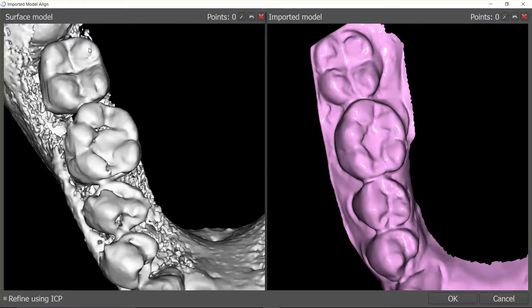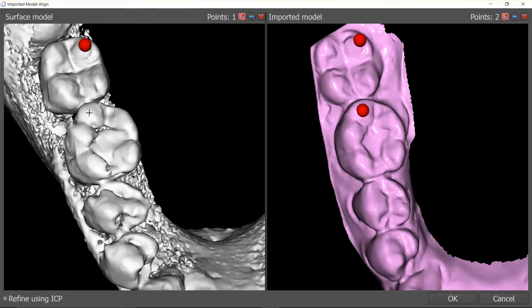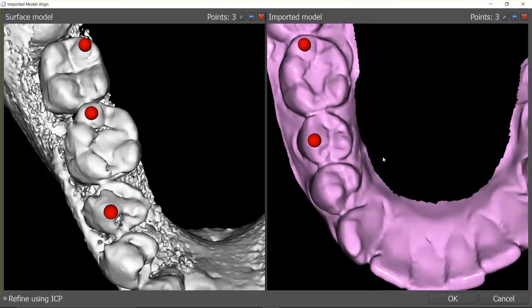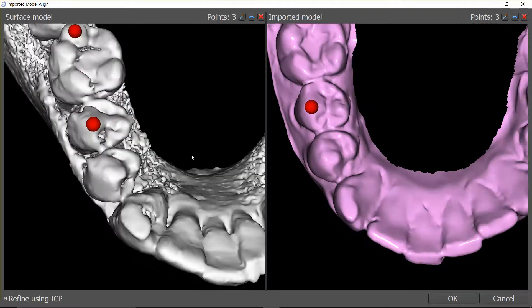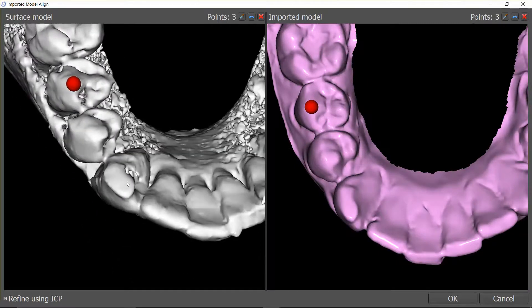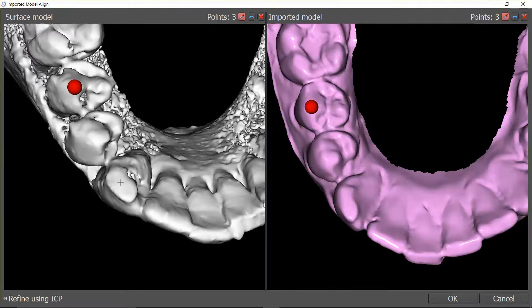I'm looking for distinct things: cusp tips, occlusal grooves, wear facets, and incisal edges — those are all really nice stitching points. This looks like a very distinct cusp tip; I'm going to put one right on the tip. Then I need to do the exact same thing on the other model, and we do that by pushing shift, which turns the cursor into a crosshair that you can drop a point with. I'll proceed around the arch. You want to get some buccal, some lingual, and definitely spread them out anteriorly and posteriorly, because otherwise you can end up with a great stitch posteriorly but lose it as you move farther away. Coming toward the anterior, I like this big wear facet on the canine — I'll put one directly in the middle of that wear facet.